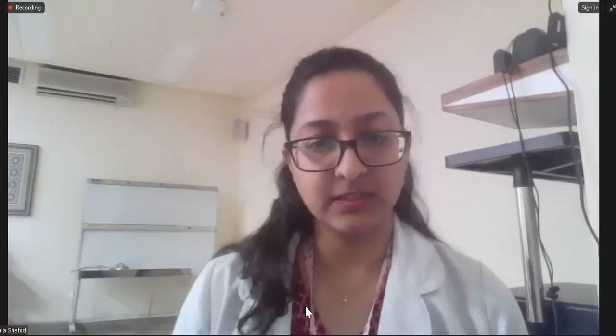The next question is directed to Dr. Maria, and it says, how effective is ultrasound as a modality for assessment of pulmonary pathologies? Any additional benefit over serial X-rays?